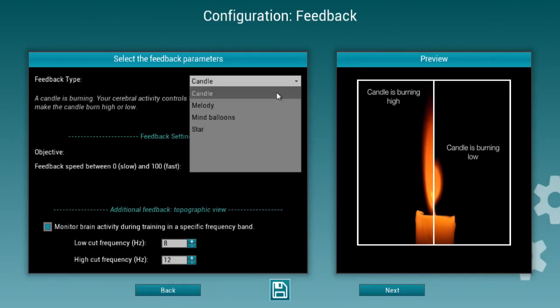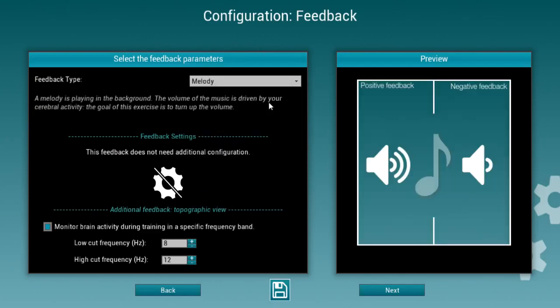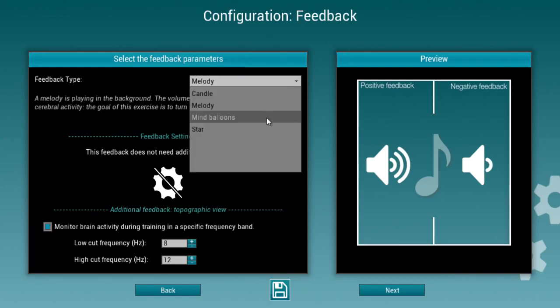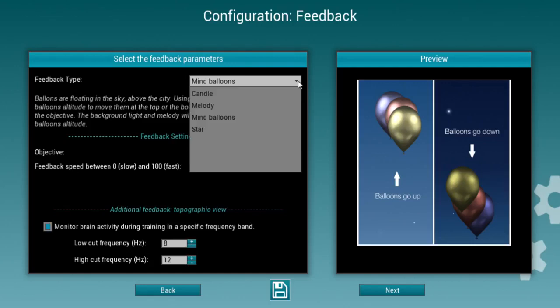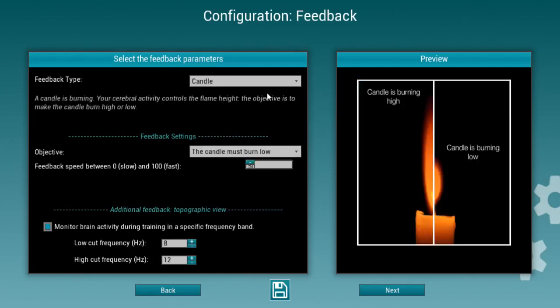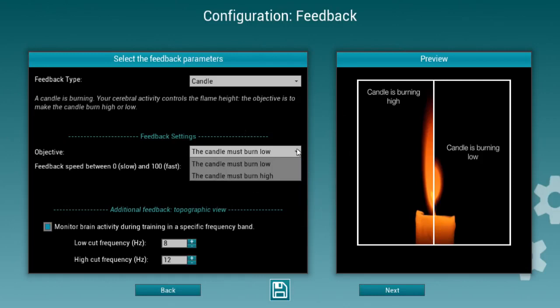You can use a candle that modulates by the amplitude of the feedback you're interested in. You can also modulate a melody that will be changed according to the feedback you're interested in — for instance, if you're using QEEG protocols. Some of you might be familiar with the Mind balloons; again, you have to decide on speed and direction.